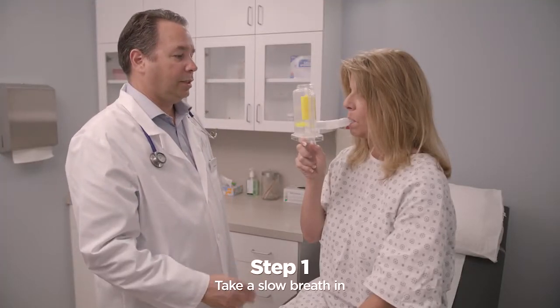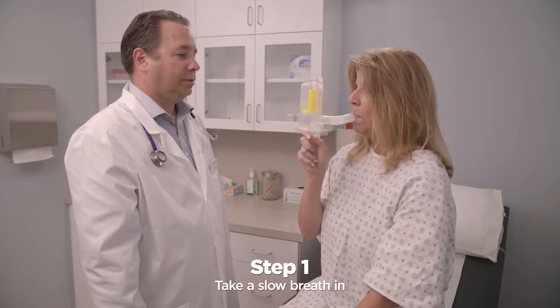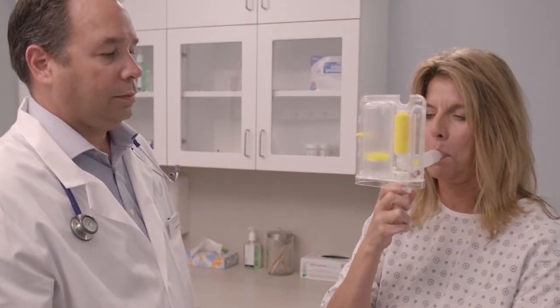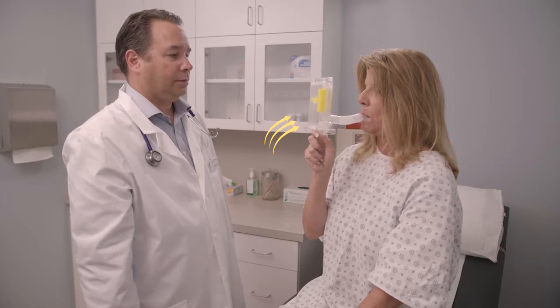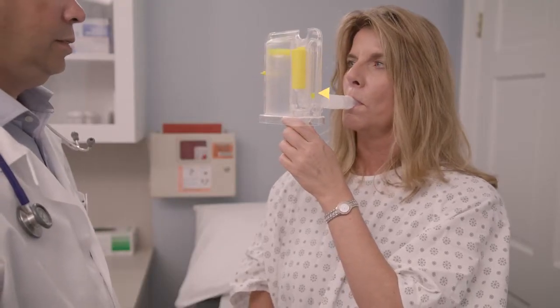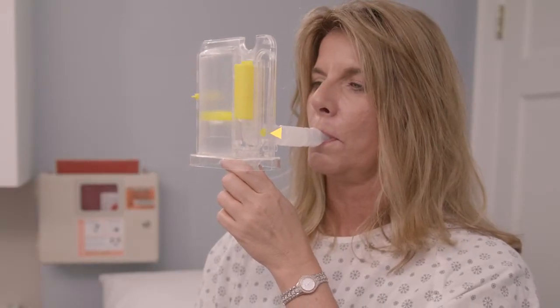Take a slow breath in. The cylinder will move up as you breathe in. Your healthcare practitioner may place the target marker to tell you how big of a breath you should take. As you breathe in, make sure that the disc stays in the middle of the chamber. If you breathe in too quickly, the disc will shoot to the top. If you breathe in too slowly, the disc will stay at the bottom.